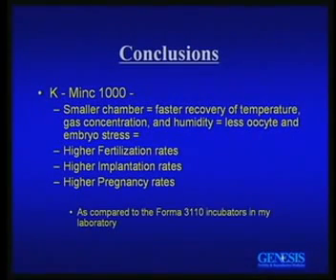So in this particular study where I looked at the same media with sibling oocytes, what I got was higher fertilization rates in the MINC, higher implantation rates, and higher pregnancy rates. And I would assume that that's because the chamber is smaller, there's a faster recovery, the gas concentration and humidity recover faster, and there's less stress on the eggs and embryos. Thank you very much.